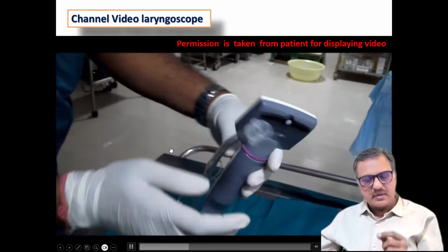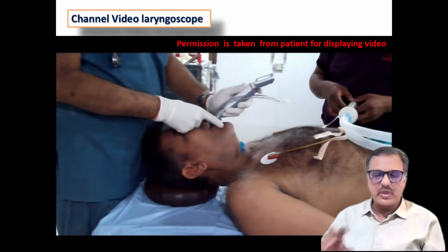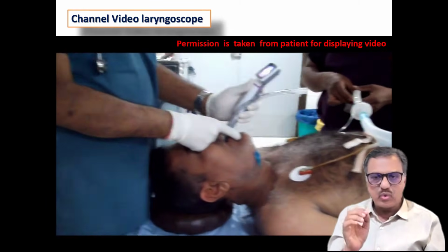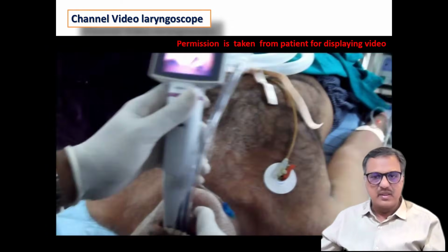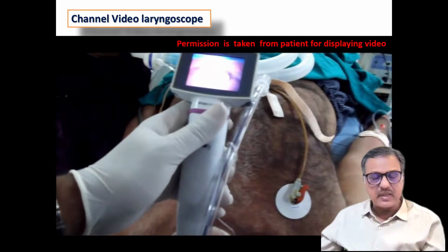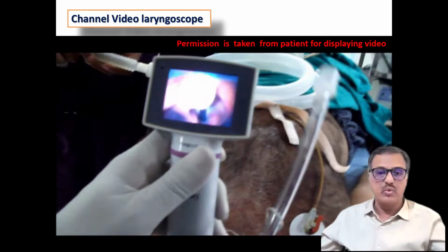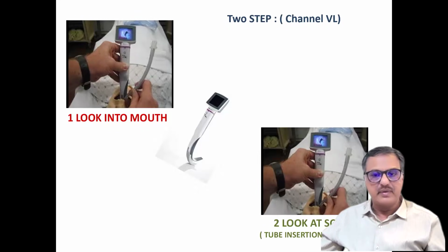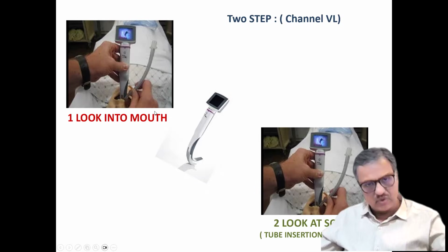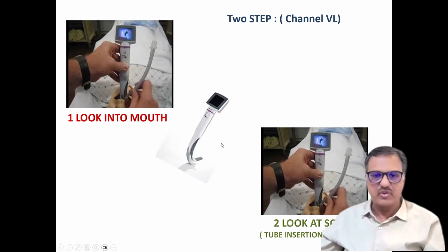And again, this assembly is to be inserted in the midline. Once you get the laryngeal view, you just have to advance the tube from the channel to the laryngeal inlet. Because of the only two-step technique, it significantly reduces the time to intubate in comparison to a non-channel anatomically curved blade. So it's only a two-step technique: look in the mouth, insert the blade with the loaded endotracheal tube, and then advance the tube inside the larynx once you get the image of the larynx.